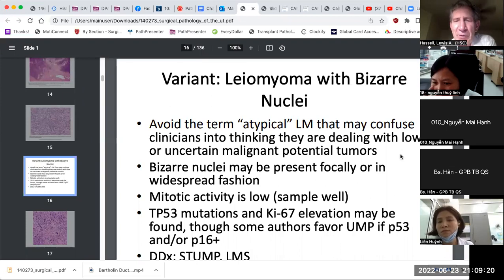So if you want to use 80% in leiomyomatous tumors, that's fine. But I don't usually do a quantitation. I don't count the cells. I use my visual impression that, gee, most all of the tumor cells are positive. I think this is a mutated status. And if it's a question, then I may suggest that they do other testing to try to verify that in those tumors. But I have not done that in the smooth muscle tumors.